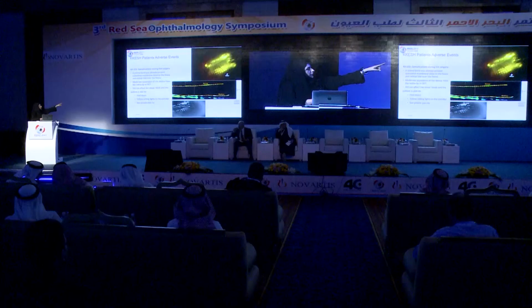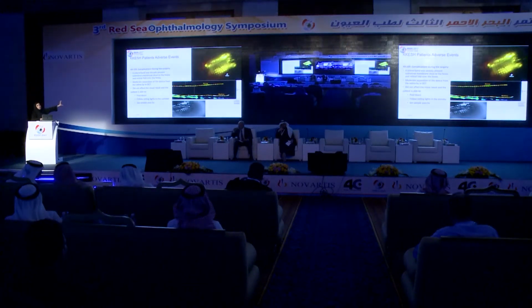And this is because the area here is less than 1,000 micrometers from the retina surface. The third one is vitreous hemorrhage, which resolved spontaneously. The fourth one is my patient with high IOP, and I recognized that the high IOP could be because I noticed that I tightened the band a bit, and we solved it by releasing the band. I just want to show you this slide, it is very important.